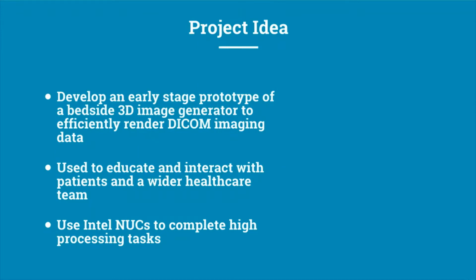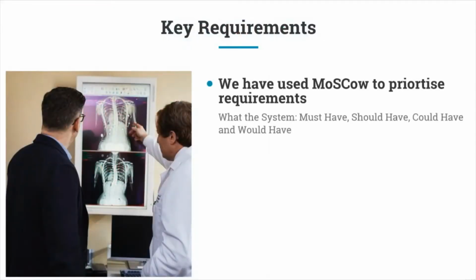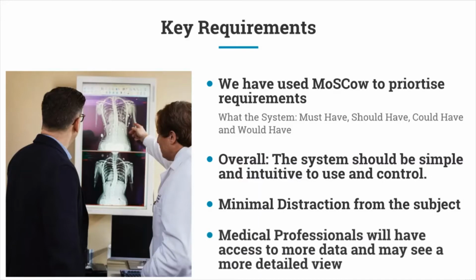Our project will make use of Intel NUCs, which are small computers that complete high-cost processing tasks. We have formulated our requirements using the Moscow method to help us prioritize the requirements of the project. We have also divided our requirements according to the intended users, who will be both medical professionals and patients. Overall, the system should be simple and intuitive to use and control. The system should also be clear with minimal distraction from the subject. However, medical professionals may be able to see a more detailed view with more data.